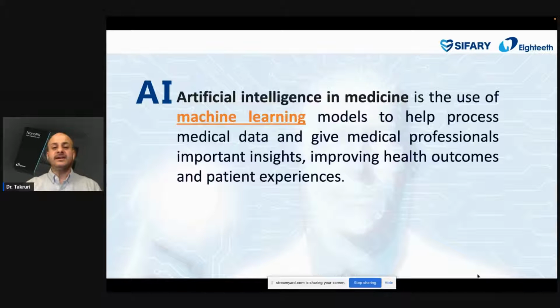Okay, what is artificial intelligence and what makes this tool very important? In this presentation, I will try to explain how this tool can be useful in our daily practice and how this tool can increase our revenue and patient acceptance for the treatment. Yes, it will increase the revenue and patient acceptance, and I will explain how.